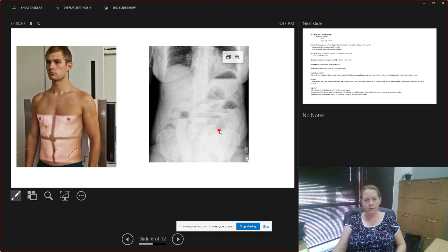All right, you see where it's making a sharp line right there, right there, right there, right there, and right there. That means that there is fluid in the abdomen or inside the small intestine that's creating an air fluid level. Just like how you have the bubble of your fundus of your stomach here, and it's got an air fluid level, that's what's creating this.